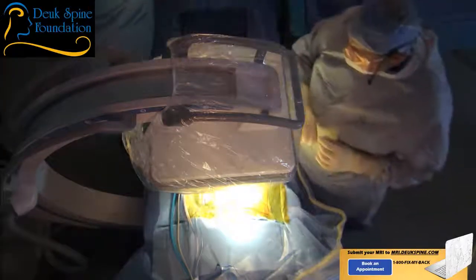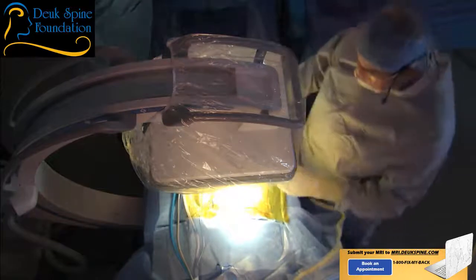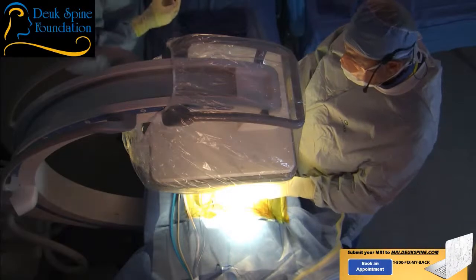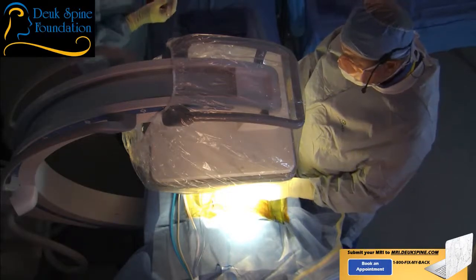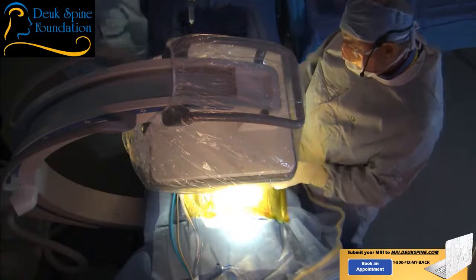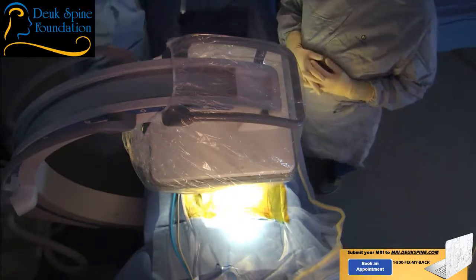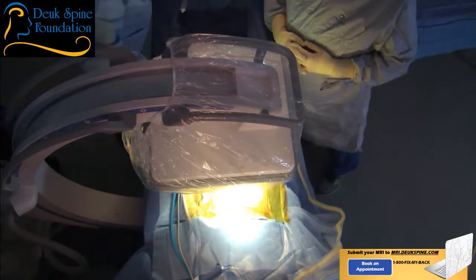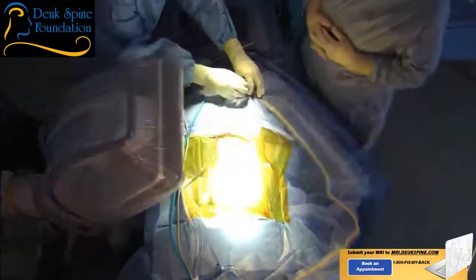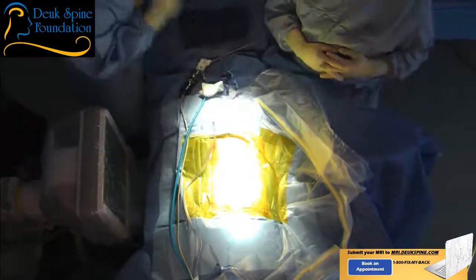I apologize — I wish there was another way to do this that was more comfortable. Four CCs injected. All right, now I'm going to be talking to my team and to our viewers, and sometimes I'll talk to you as well, sir. Let's go lateral — we're going to use an X-ray machine to look at the spine.